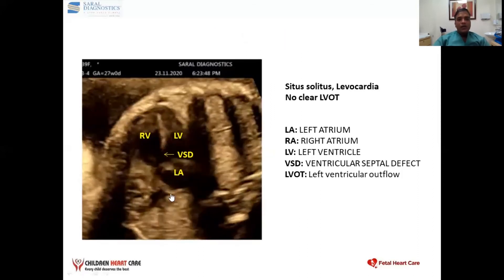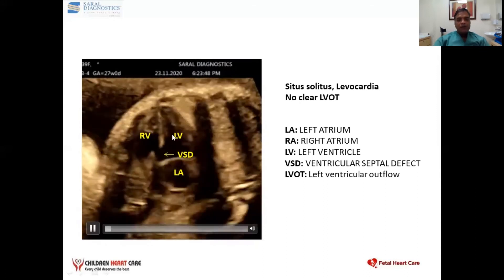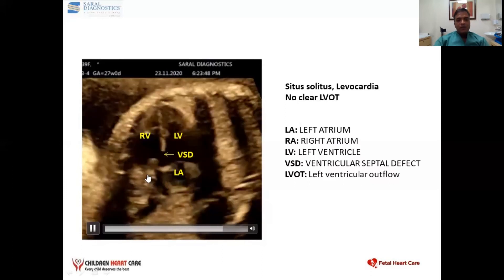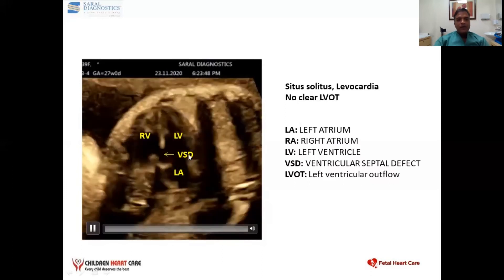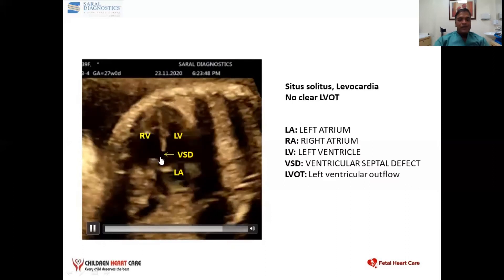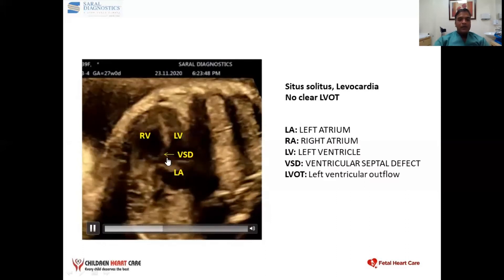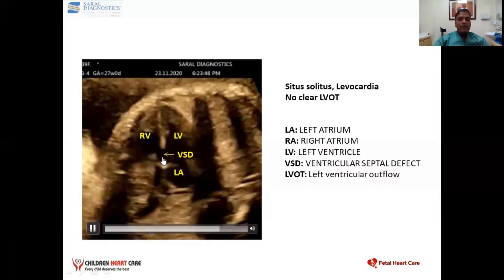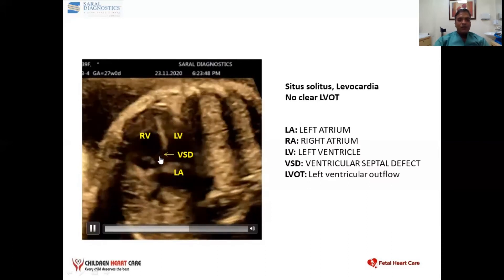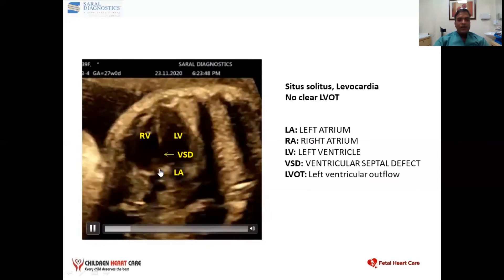As you can see in this echo clip, this is the left atrium, left ventricle, right ventricle, and the right atrium is somewhere here. As you can see, there is a big hole here — this was a VSD. Normally the septum is clearly visible here, but there is a big gap. Something is coming out from above the VSD, but it is not very clear.